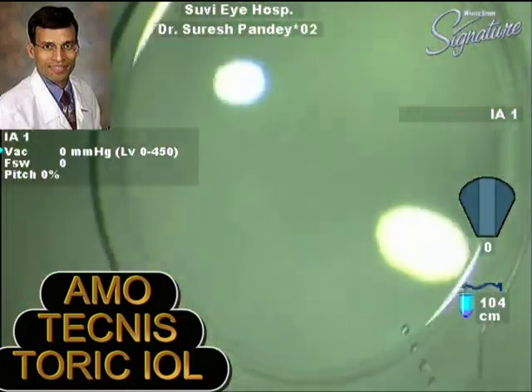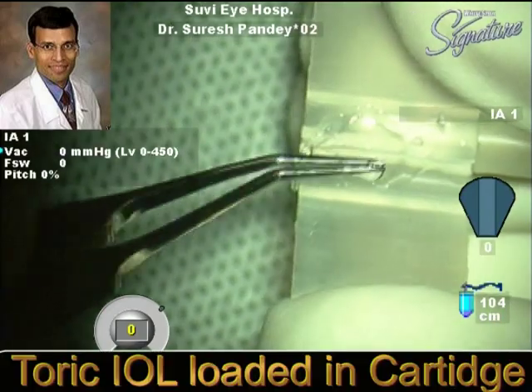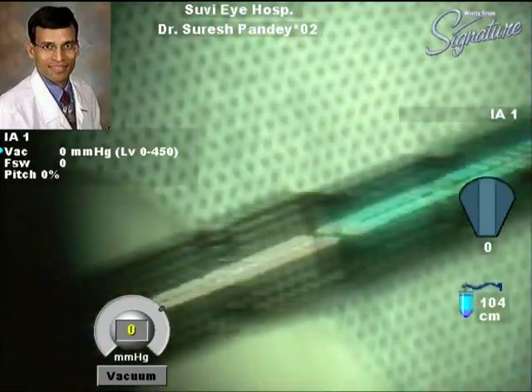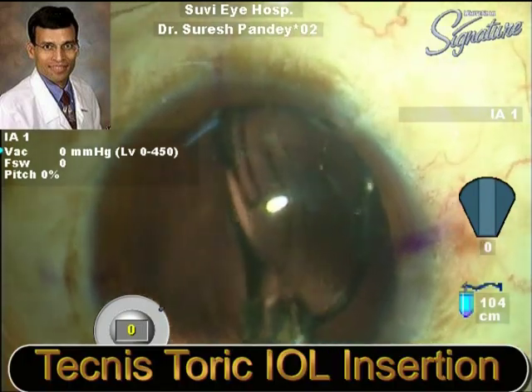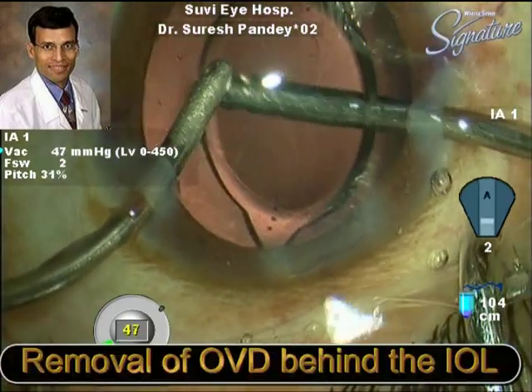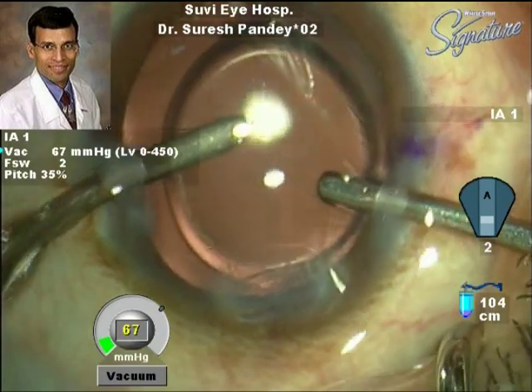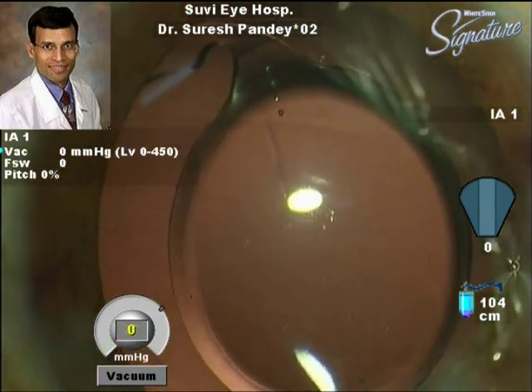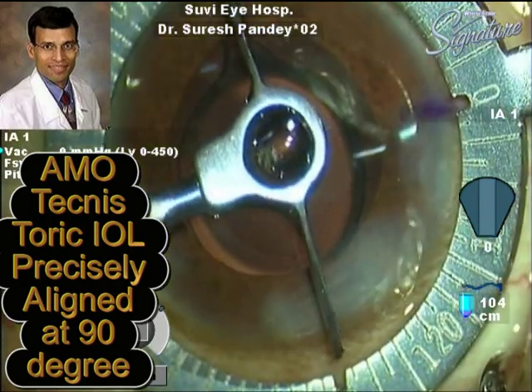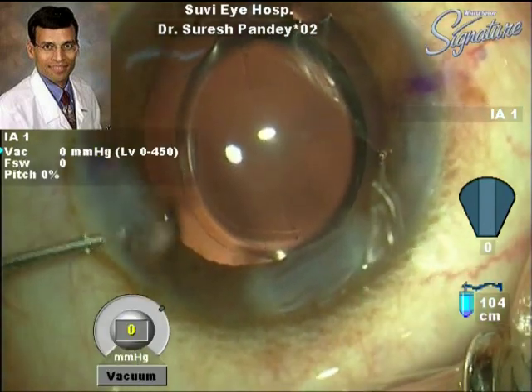The patient's IOL power was +21.5 diopters with a 1.5 diopter cylindrical add as per this IOL configuration. As you can see, the IOL has four marks to help in alignment with the astigmatic axis. The IOL is placed in the injector, and using the Emerald injector the TechnosToric single-piece IOL is being implanted. The IOL is very well placed in the capsular bag and the viscoelastic is being removed from under it. As standard practice for any toric IOL, the IOL is placed a little away from the astigmatic axis initially, and once the viscoelastic is completely removed, the IOL is gently nudged into perfect position.